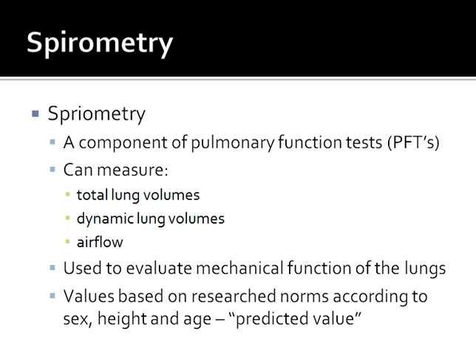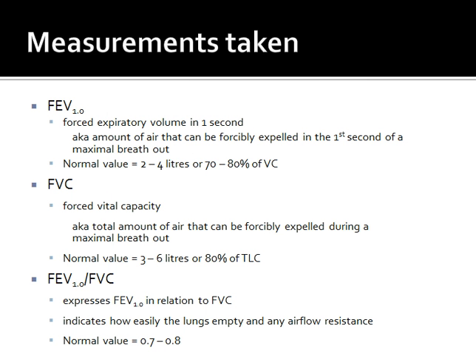But there's been a lot of work done quite a while ago now, based on normal values, and so there is a way of predicting what an individual should be able to achieve with their lung volume, and that tends to be based on gender, height and age, and we know that these factors influence what we expect someone to achieve.